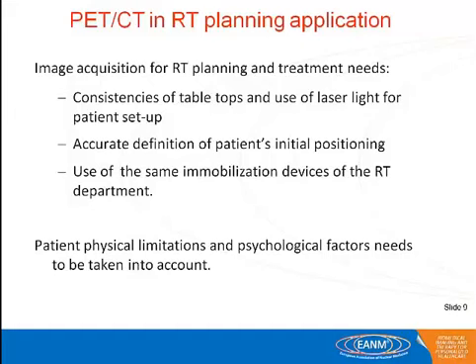Patient physical limitations and psychological factors need to be taken into account. A PET scan lasts from 20 to 30 minutes. It's a long while, and it can be really stressful for the patient. Physical condition may really change among people. Sometimes they are really suffering during PET-CT for radiotherapy planning. We have to take these kinds of problems into account.